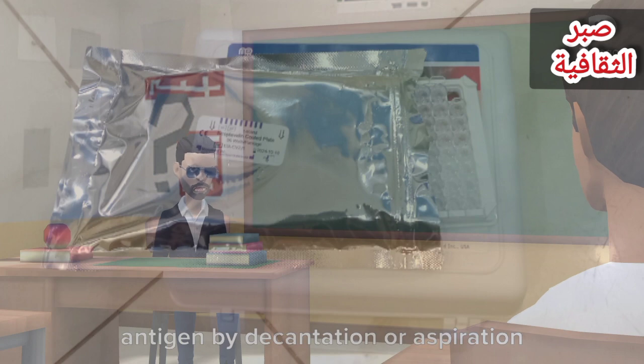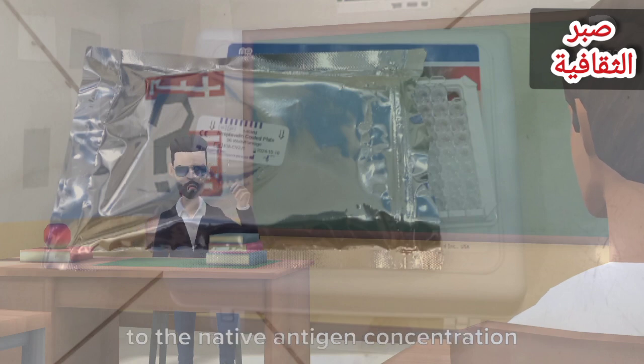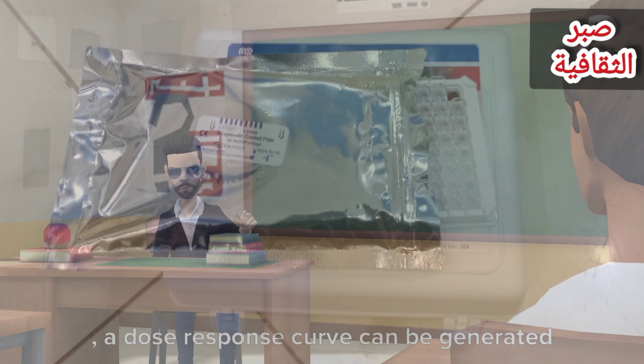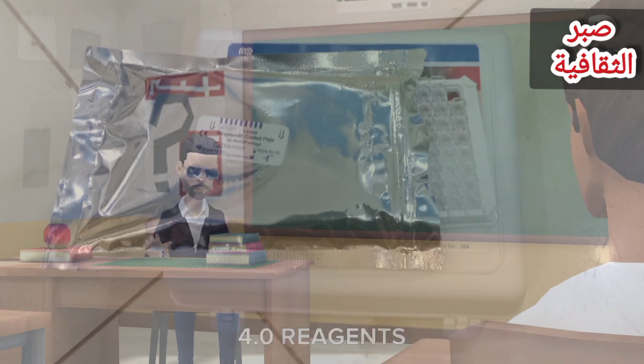attained. The antibody-bound fraction is separated from unbound antigen by decantation or aspiration. The enzyme activity in the antibody-bound fraction is directly proportional to the native antigen concentration. By utilizing several different serum references of known antigen values, a dose-response curve can be generated from which the antigen concentration of an unknown can be ascertained.